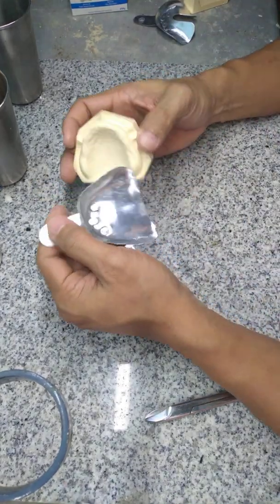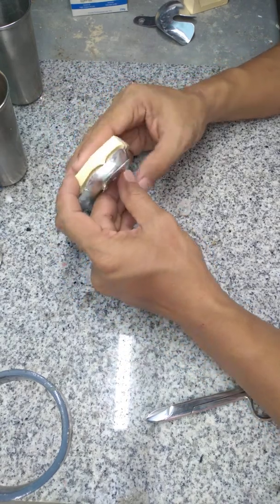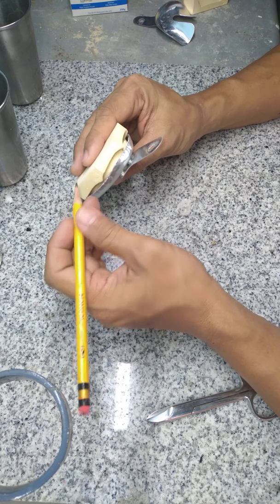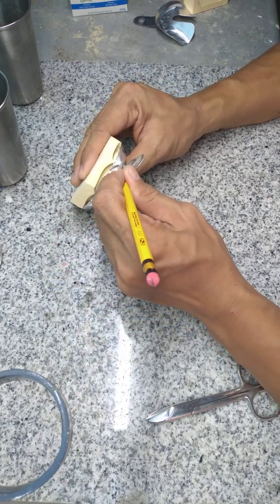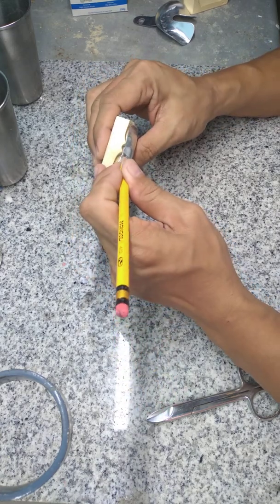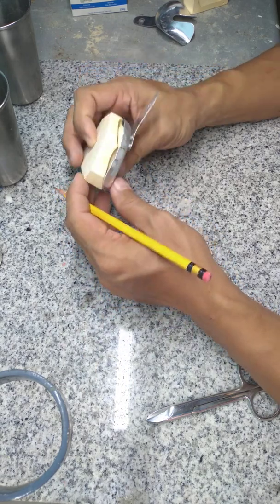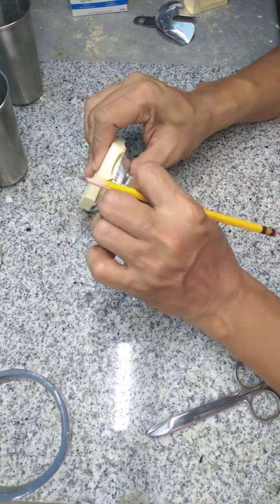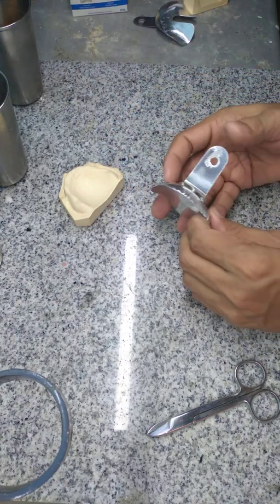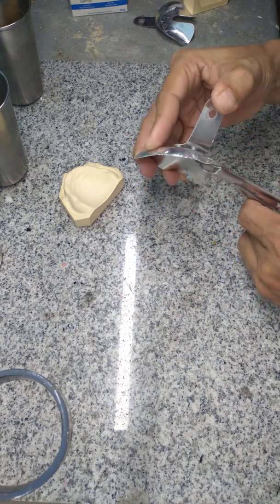We start to modify your maxillary stock tray. If this is the patient's mouth, of course we can't write on the patient's mouth, but we can write on the stock tray. For the frenum — for this model, we have two buccal frenums on the left side and one on the right. We can bend the handle and make provision for the frenum notch.